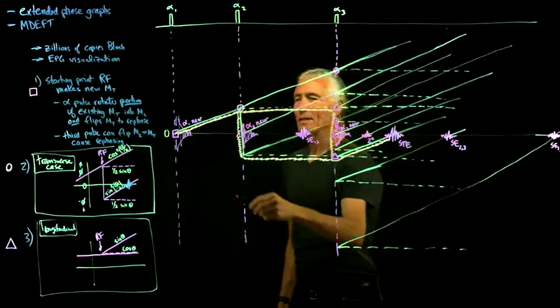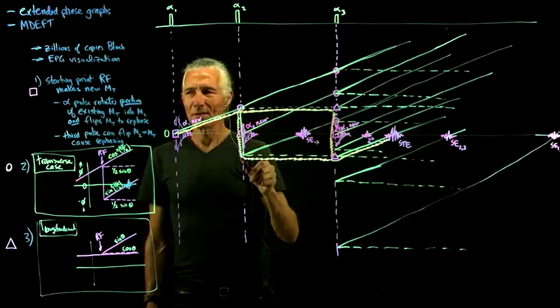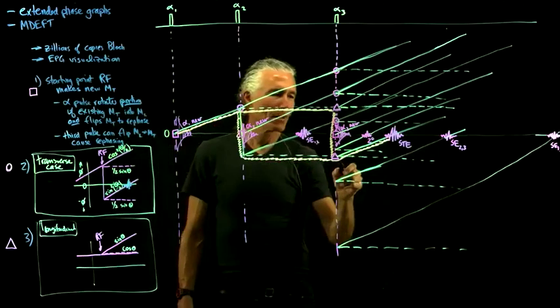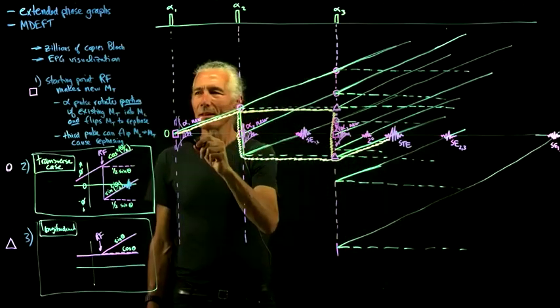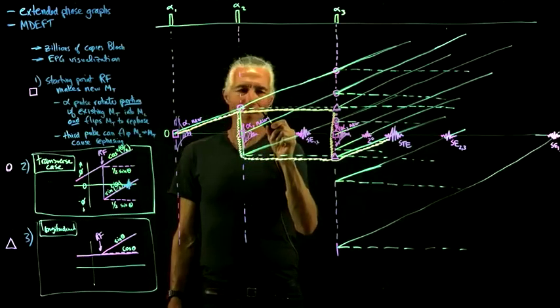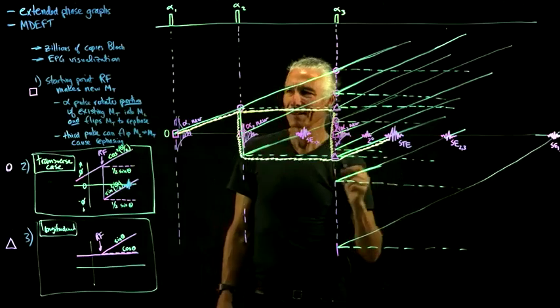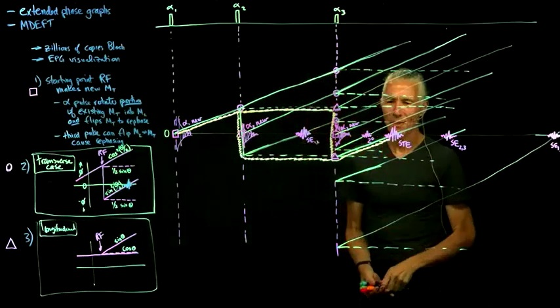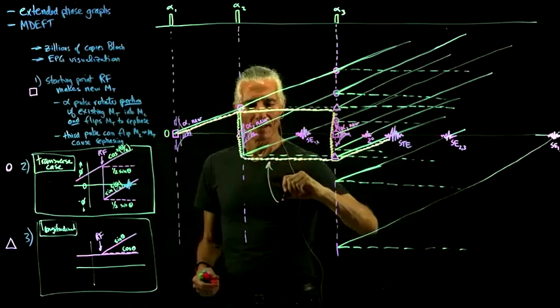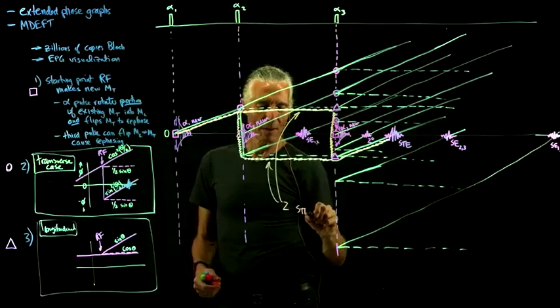So you could either dephase, flip 180, get saved, and then rephase, or you could dephase, get saved without flipping 180, then flip 180, then rephase. And so these were the 2 stimulated echo pathways.